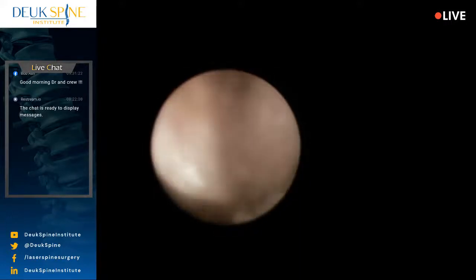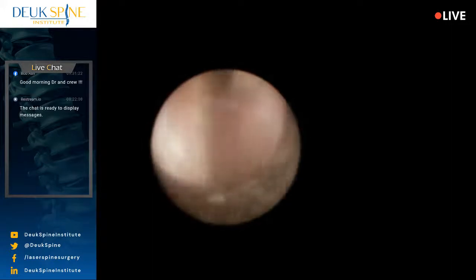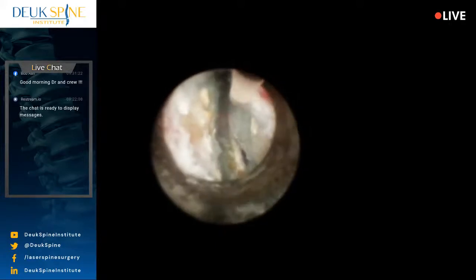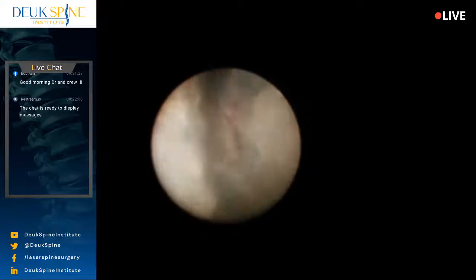but this surgery typically gets rid of 90% if you treat all the discs that need to be treated. Now, not every patient wants to treat all the discs. They want to treat just a few, maybe one in this case. And like I said, this patient in particular has more than one abnormal disc, but we're just treating the one disc, the one that we believe is causing most of her symptoms.